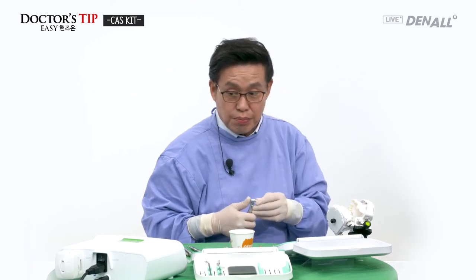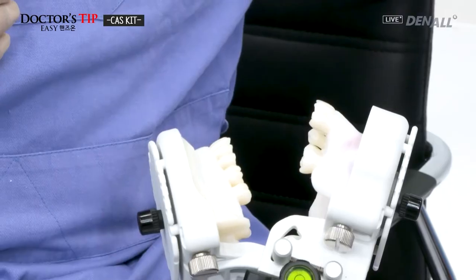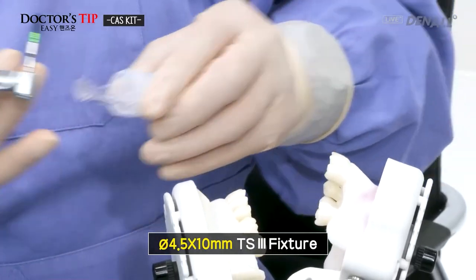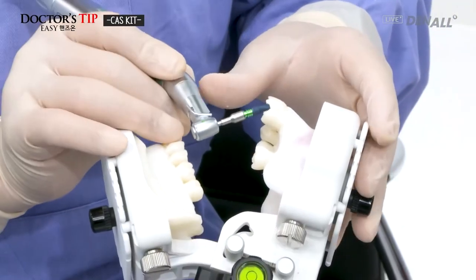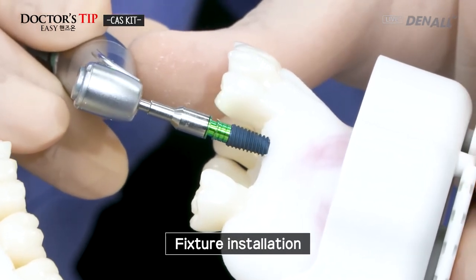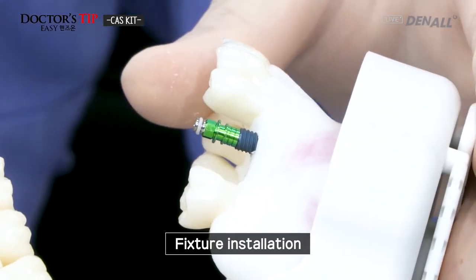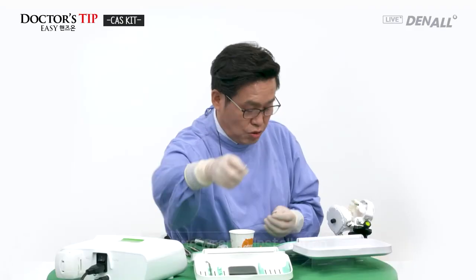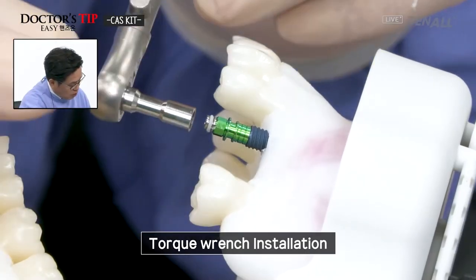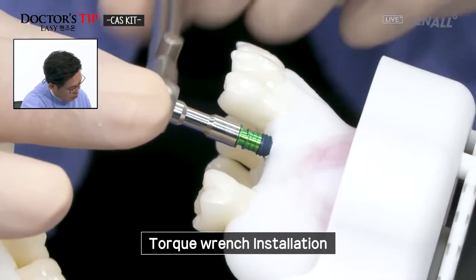Next, the implant is to be placed using the mount driver. A 4.5 diameter by 10 millimeter long fixture is to be placed. The mode of operation should be checked, whether it is fixture installation mode. So the torque is high. Using the hand wrench, positioning will be done. Using the hand wrench, it is fully seated.